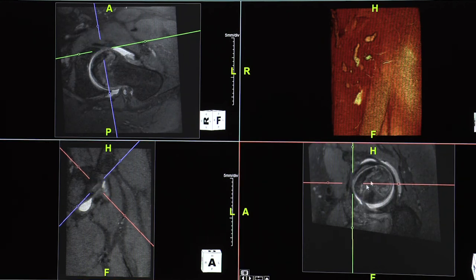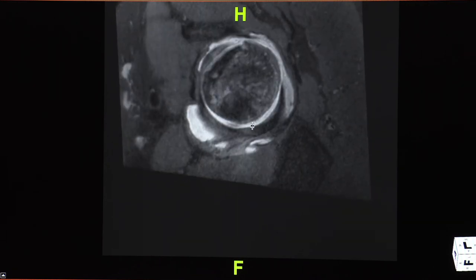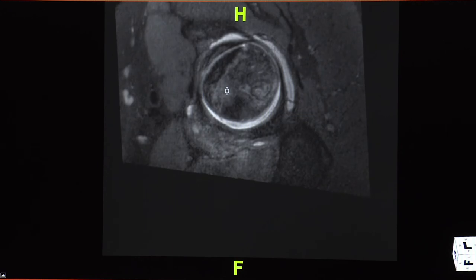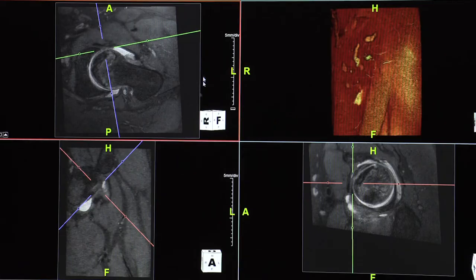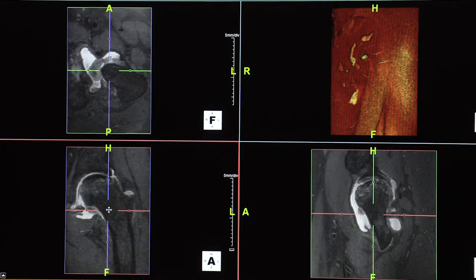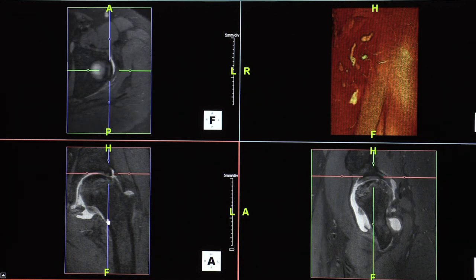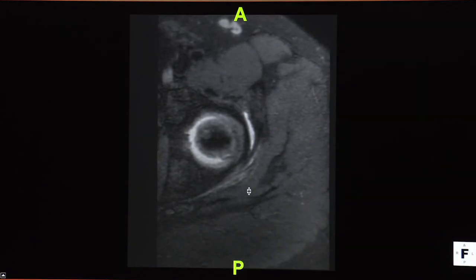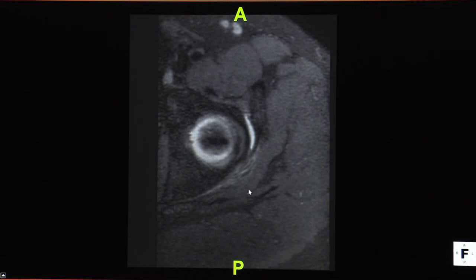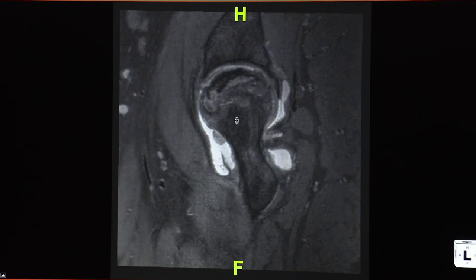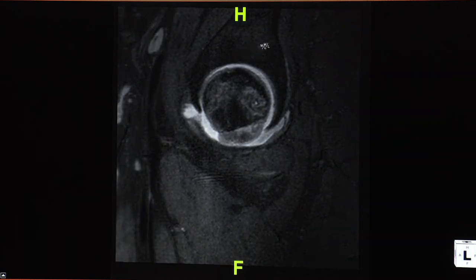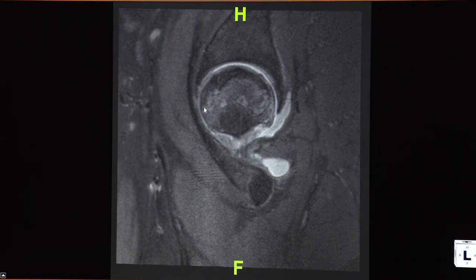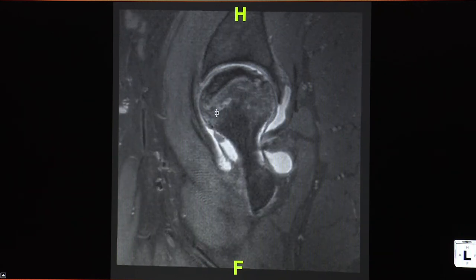To see that tear in another plane, go along the axis right here and look at the sagittal images. Here is the acetabular cartilage, the femoral cartilage, and as you follow this, the tear is visible — though harder to see. Do a reset and reorient along the labrum. You can see the normal labrum, then as you scroll through, the inferior edge is missing. Scrolling further, it's missing here too — that's the full extent of the labral tear we were seeing.